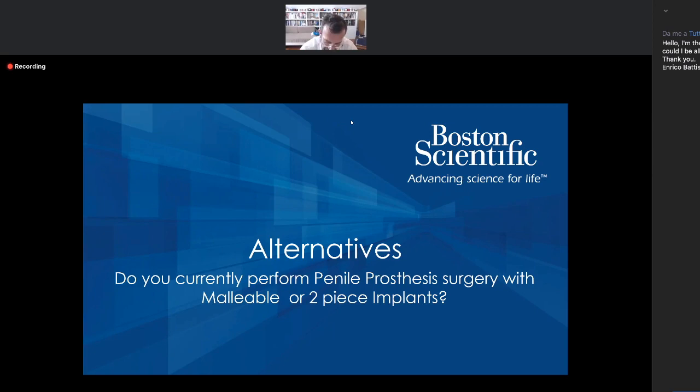And probably the morphological aspect of the penis, when you activate it, is better with an infrapubic approach in comparison to the penoscrotal approach. Also, homosexual patients are probably more sexually active in comparison to the heterosexual patients who deserve a penile prosthesis, and they are also very mindful of the aesthetic aspect of their penis. So if the patient is not very old and they come with the partner, I would suggest the patient go ahead with the infrapubic approach.